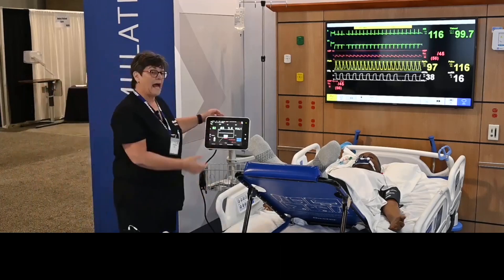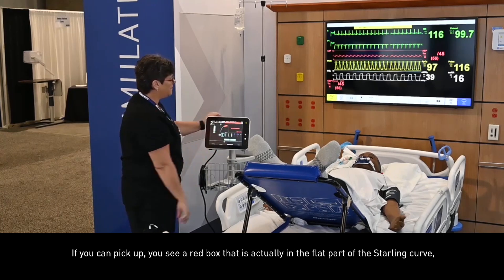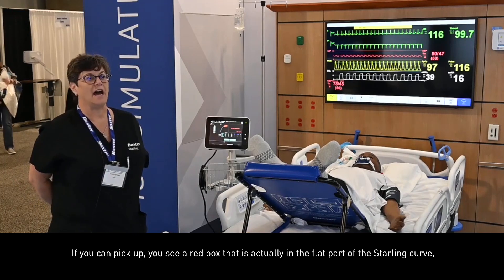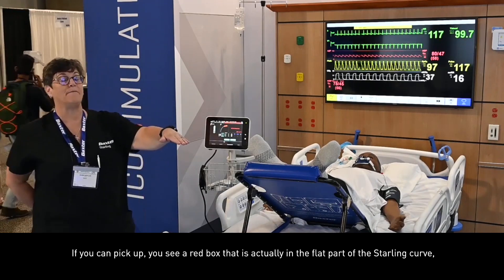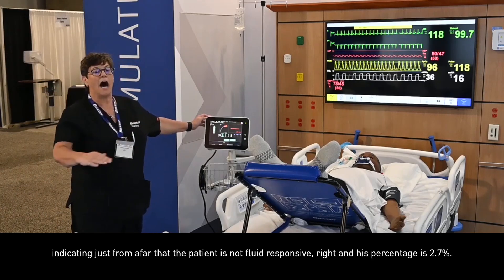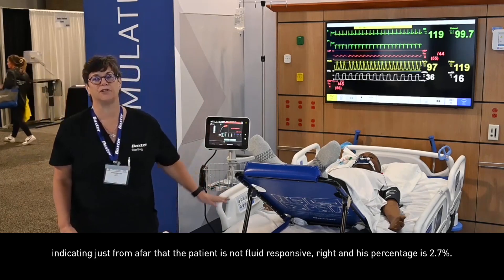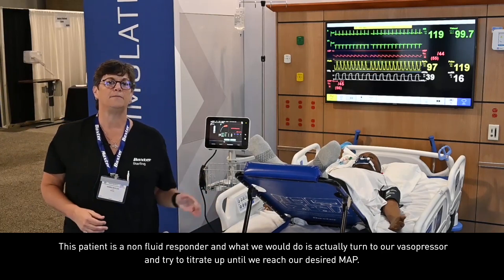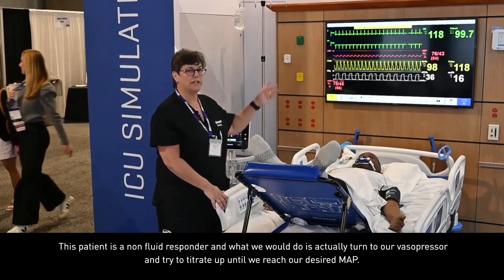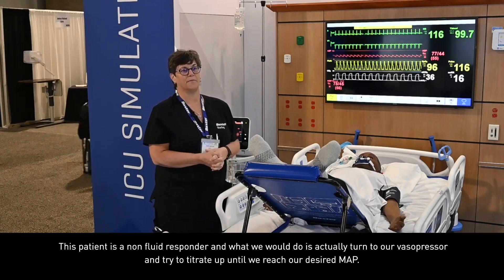We actually have our results now, so let's walk through them. You can see a red box that is in the flat part of the Starling Curve, indicating that the patient is not fluid-responsive. His percentage is 2.7%, which is less than 10%. This patient is a non-fluid responder, and what we would do is turn to our vasopressor and titrate up until we reach our desired MAP.